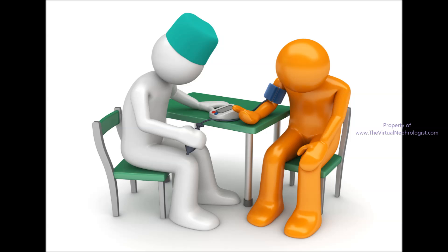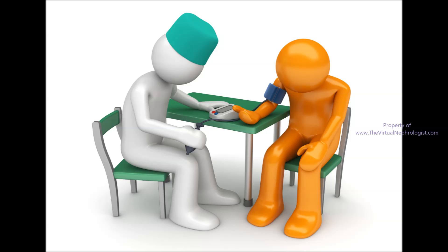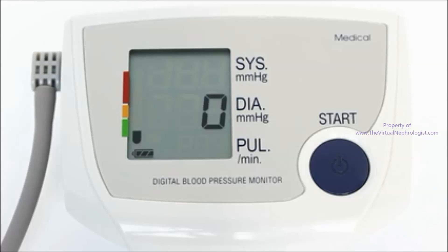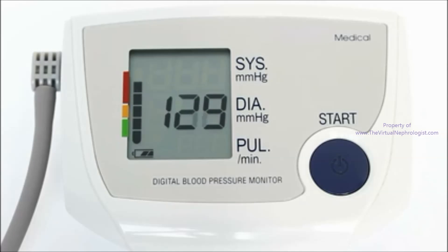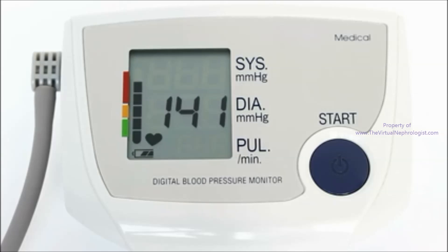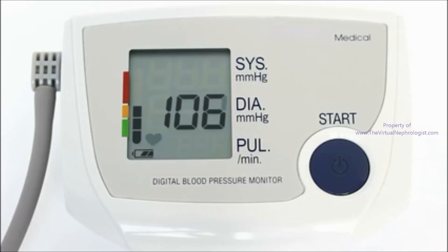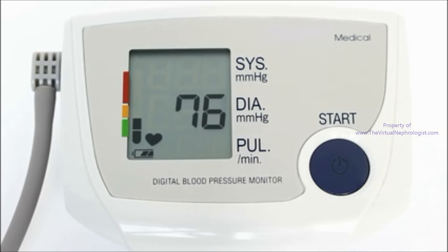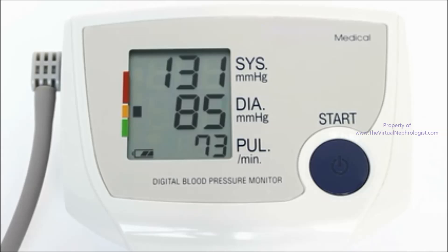The diagnosis and treatment of hypertension depends on the accurate and appropriate measurement of blood pressure. The top number is the systolic blood pressure and the bottom number is the diastolic blood pressure. Your health care provider will evaluate the readings and decide what to do in regards to medications for the treatment and control of elevated blood pressure, if present.